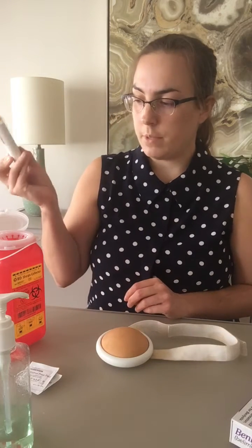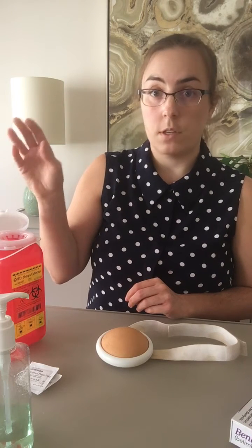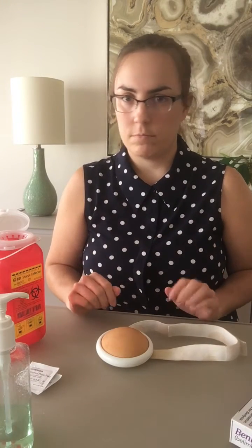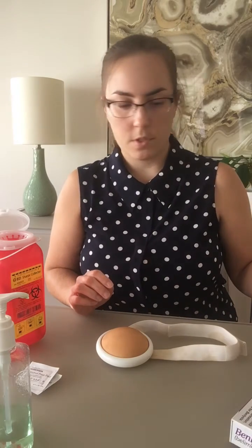Place the medication into a sharps container. There may be a little bit of bleeding — this is perfectly normal. Simply put a band-aid and that should do the trick. That is how to inject Benlista with an auto injector.